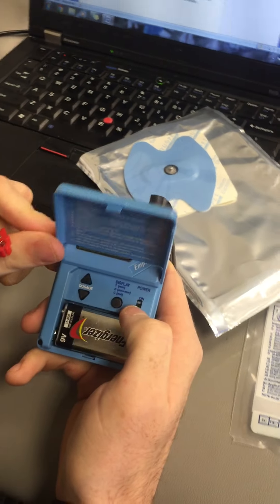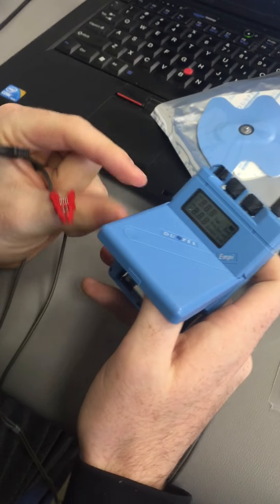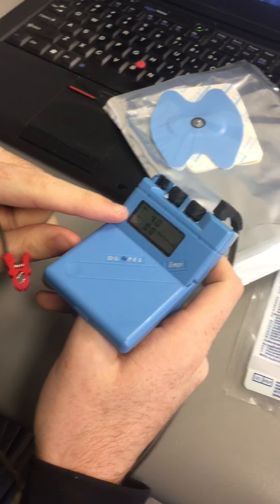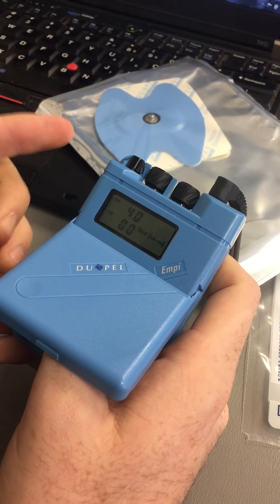Come over to the device, turn it on — make sure it's set to S1 primarily, then turn on the device. The first thing you set is your total current for the whole treatment. 40 is a good point to start, and you can go from 40 to 80.